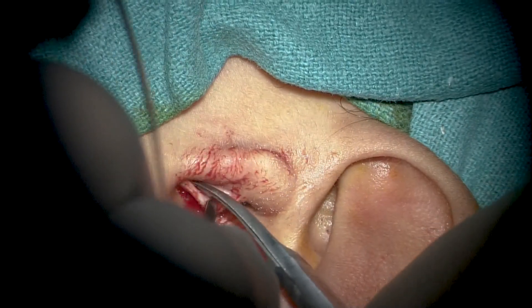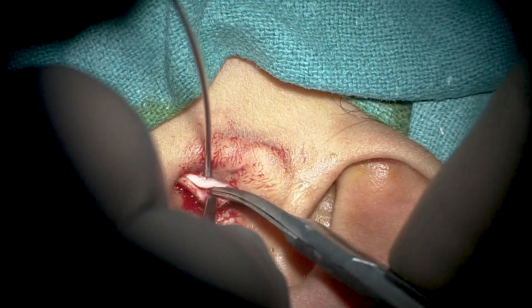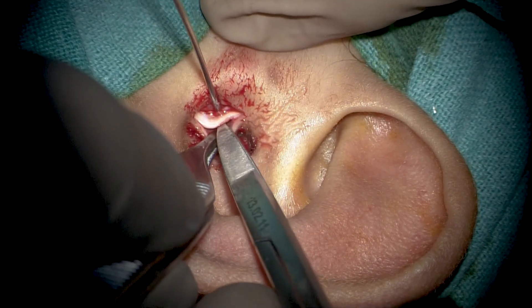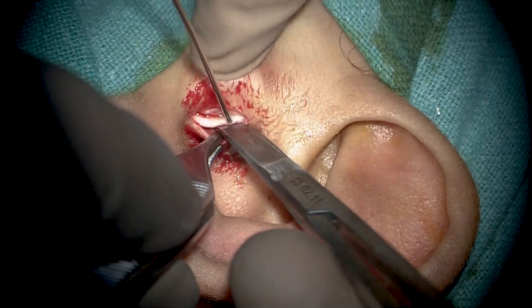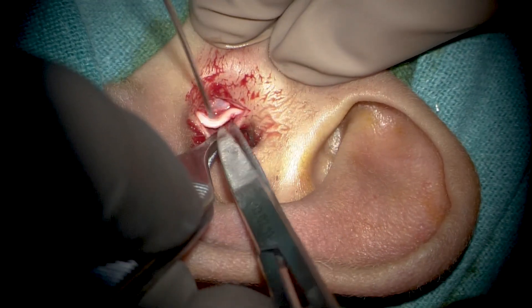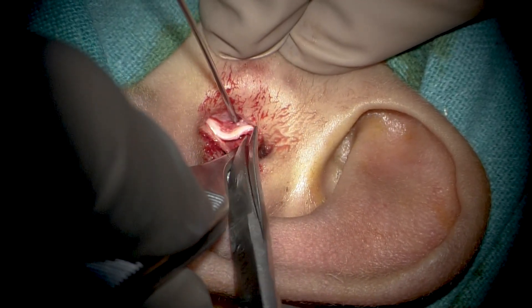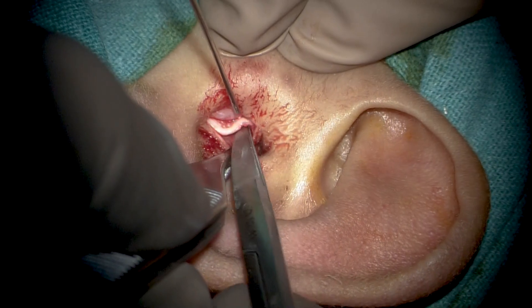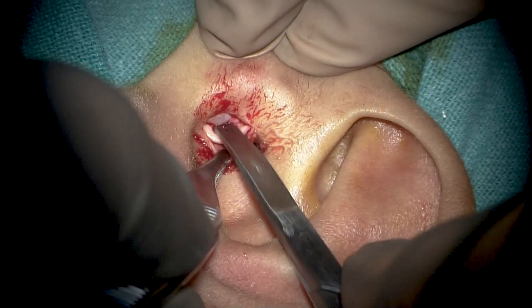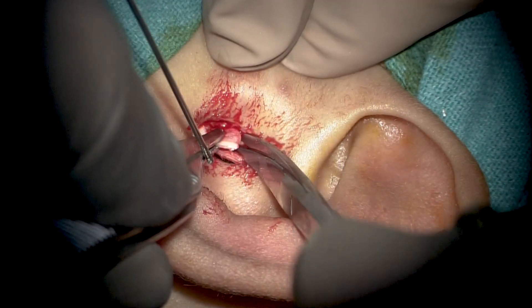When harvesting tragal cartilage, one must be very careful not to destroy the dome of the tragal cartilage, as that is important for cosmetic function. The incision is always given 2 to 3 millimeters medial to the dome, and we must only harvest the amount of cartilage required. Since here we only need to augment the posterior half or posterior third of the drum, we harvest a semi-lunar shaped piece accordingly. If one were to reconstruct the entire drum with cartilage or use it for cavity obliteration, a larger piece could be taken.